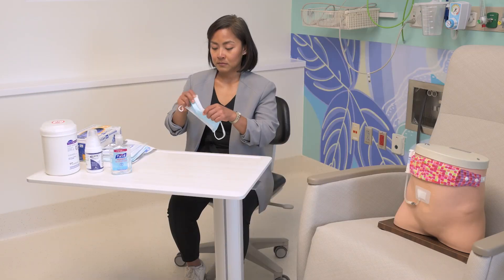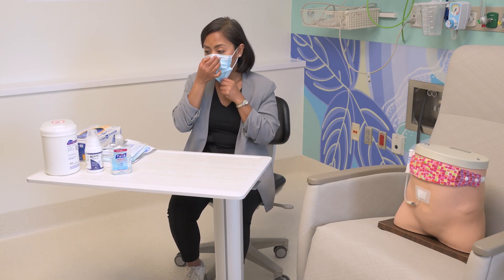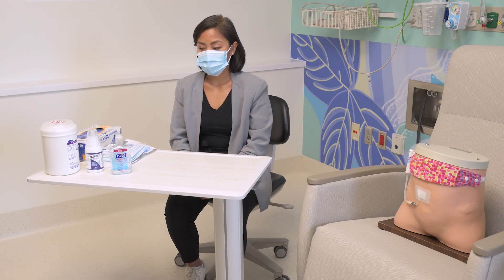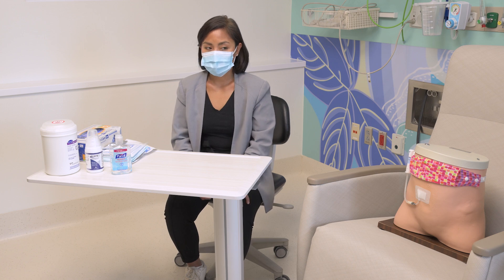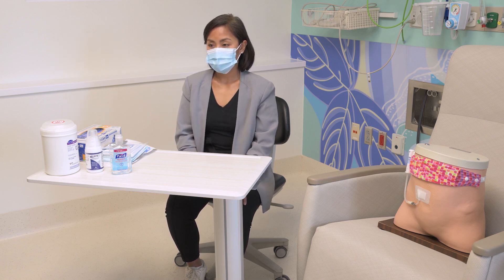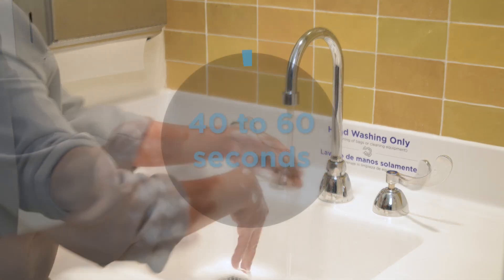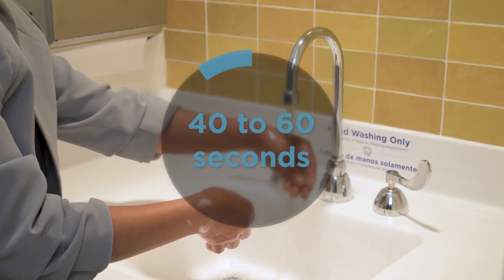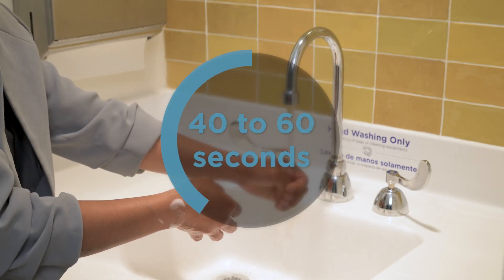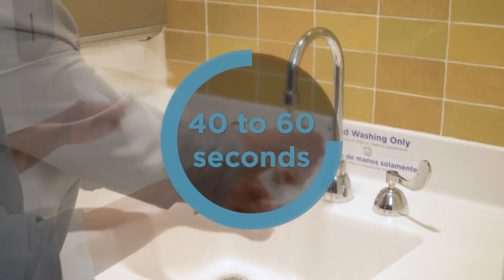Put on a mask. The person on dialysis and everyone in the area needs to wear a mask. Close any open doors or windows. The next step is to wash your hands for 40 seconds to 1 minute. This seems like a long time, but it is important.